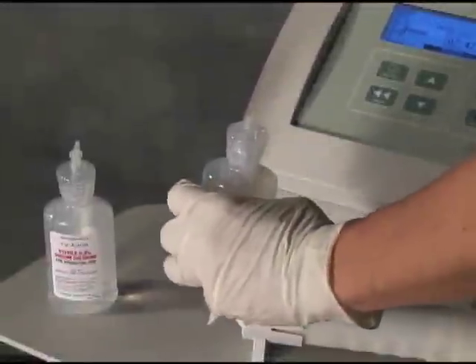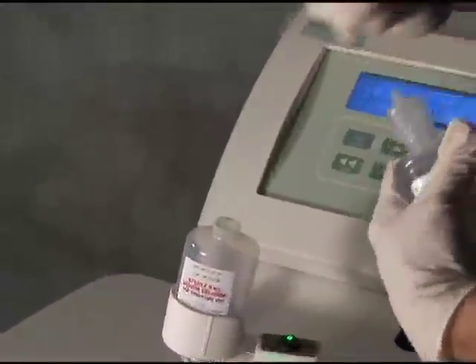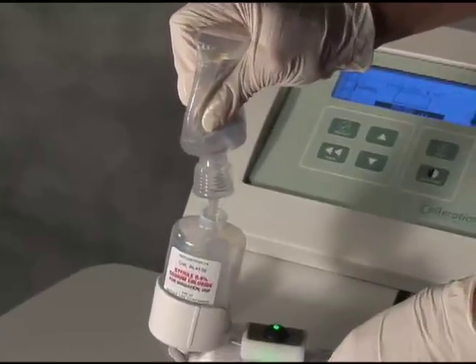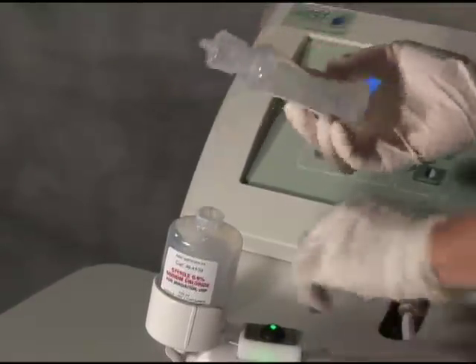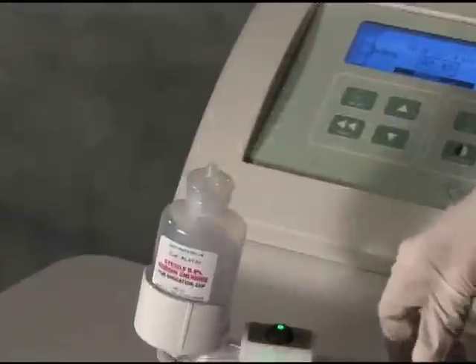To refill, remove the cap from the initial saline bottle that is already seated in the applicator assembly. If you know in advance that you will be refilling for longer treatment times, it is recommended that the cap be removed before starting the initial treatment. Refill the saline bottle and continue the treatment.